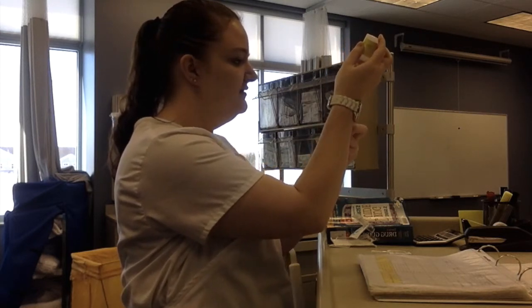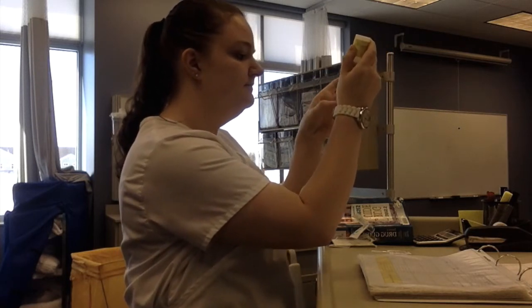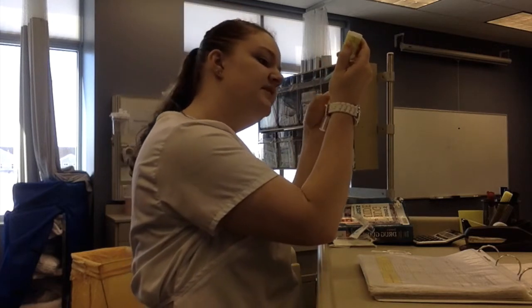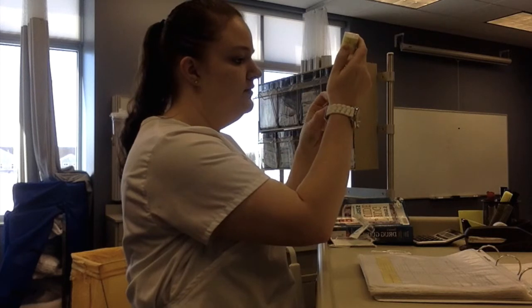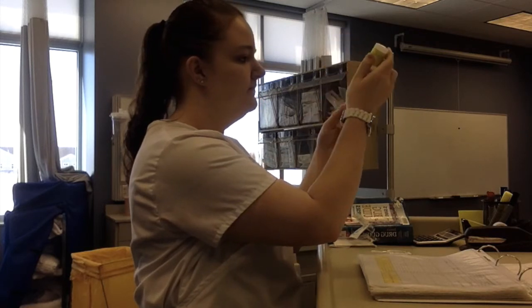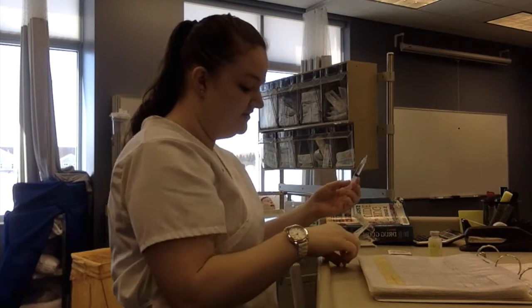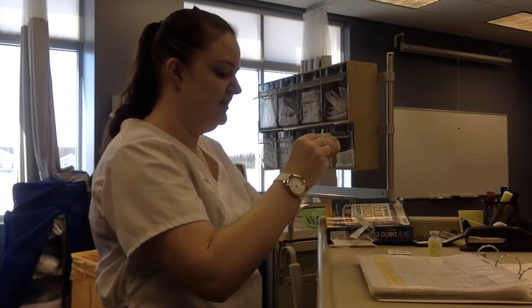A little excess so we can get the bubbles out. I would make sure all the bubbles are out of my syringe. Then I would push it back to 2 milliliters. Pull it out of my vial. I would then use the scoop technique to recap my needle. I would secure it.